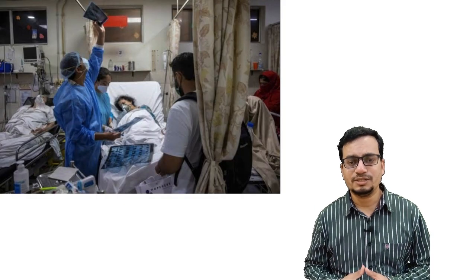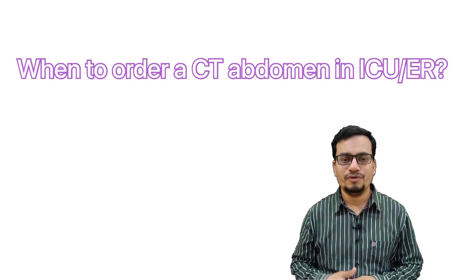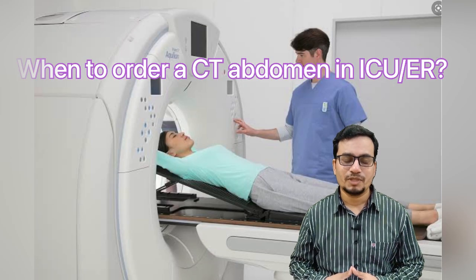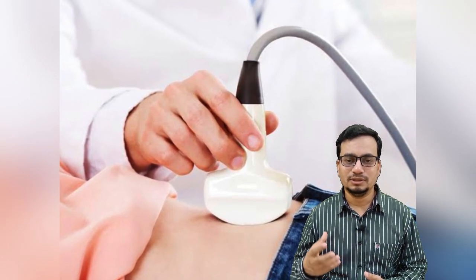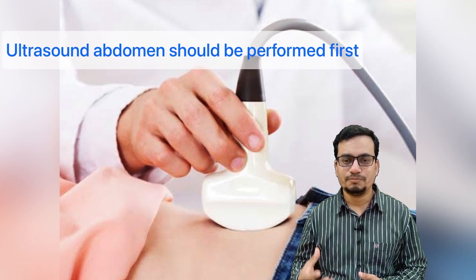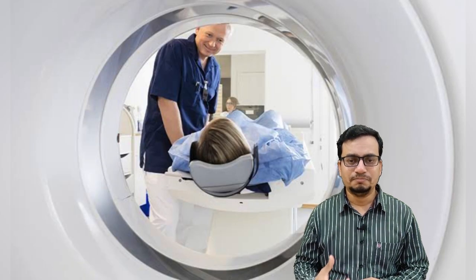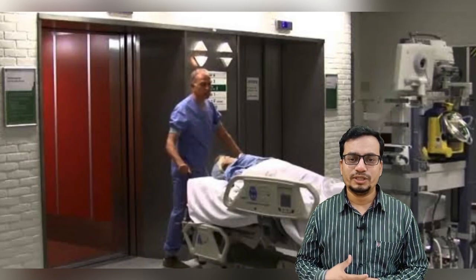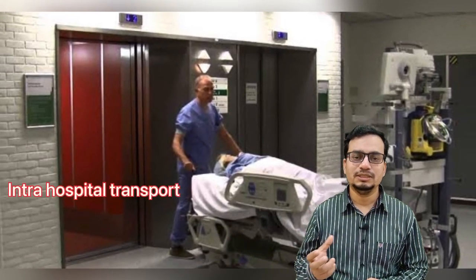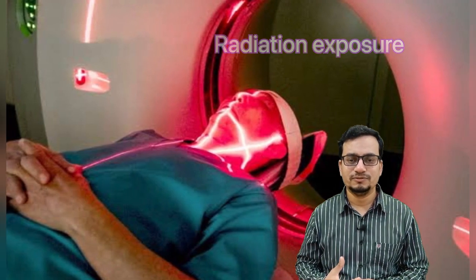So what are the main indications of abdominal CT in critical care or emergency areas? You should know when to order a CT abdomen. CT imaging should be used once ultrasound is inconclusive. If it is not able to make a proper diagnosis and there is a doubt on ultrasound, then obviously you have to perform a CT abdomen. That's important because CT abdomen is a costly investigation, it requires shifting the patient to the CT suite, and also lots of radiation exposure is involved.